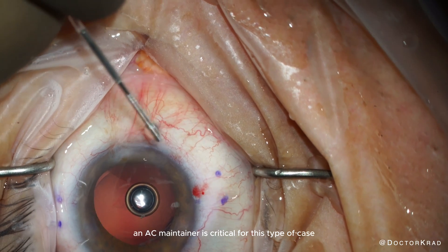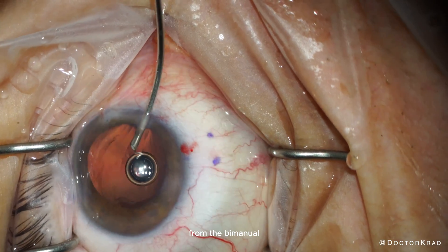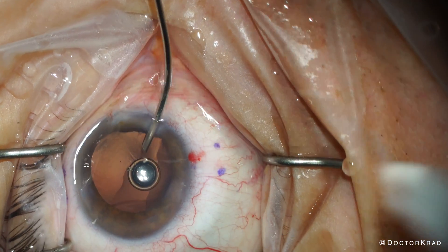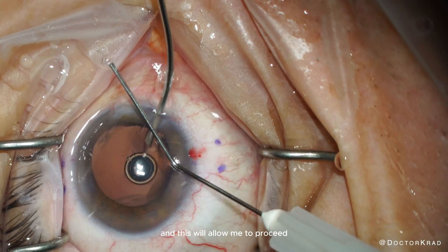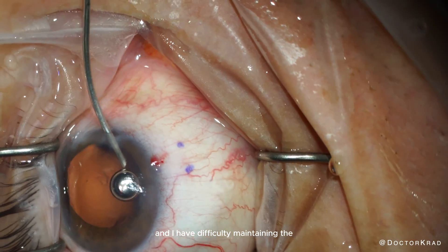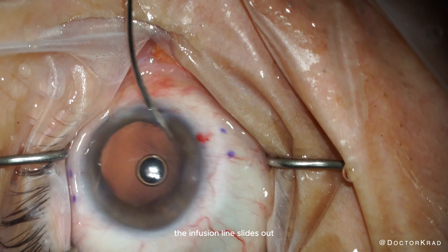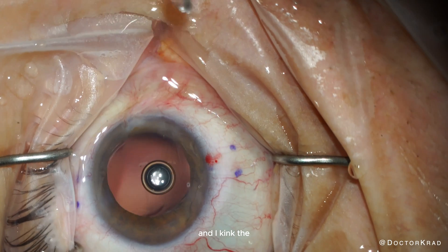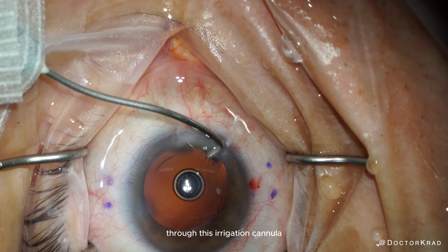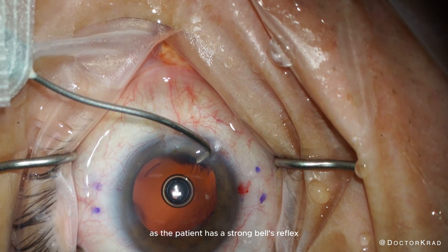An AC maintainer is critical for this type of case. Without a backup, I decide to use the irrigation cannula from the bimanual vitrectomy set. This cannula is not serrated, so it will slide out unexpectedly, but it provides excellent infusion pressure and allows me to proceed. Shortly thereafter, the patient starts to squeeze his eye, causing a Bell's reflex, and I have difficulty maintaining the eye in primary position. After wrestling with it, the infusion line slides out. So I kink the line to try to hold the eye in primary position — the eye pressure remains appropriate with good infusion through this irrigation cannula.